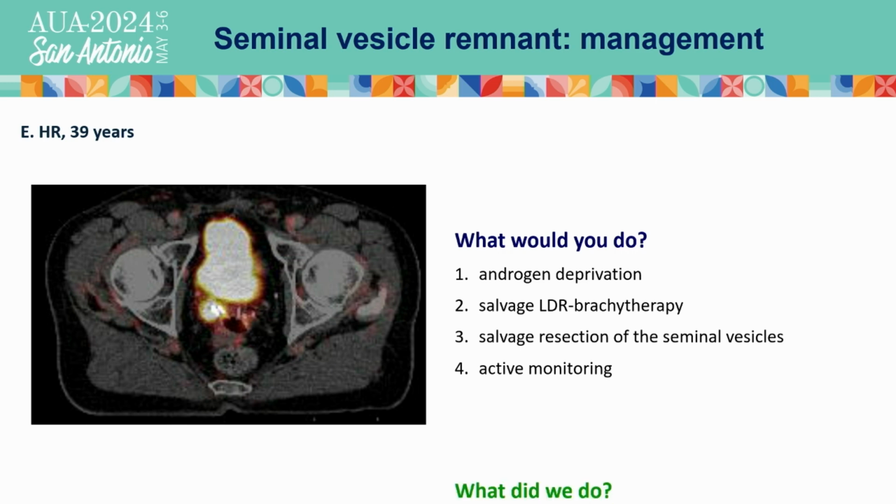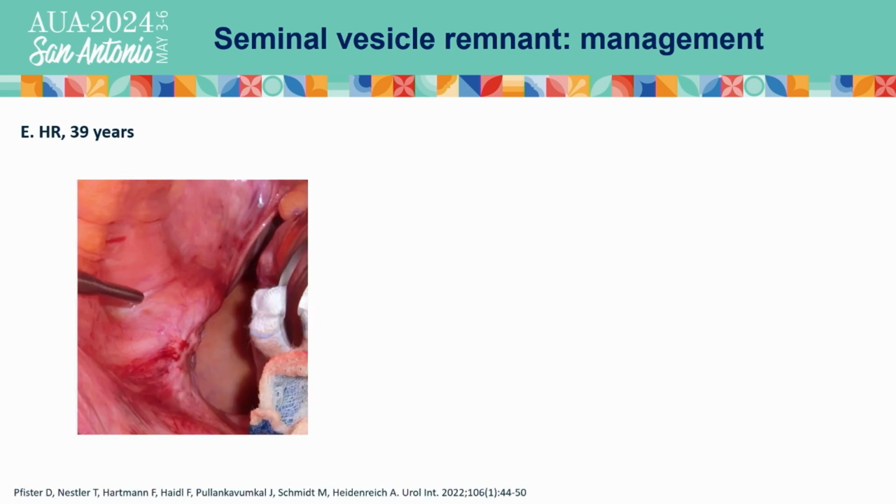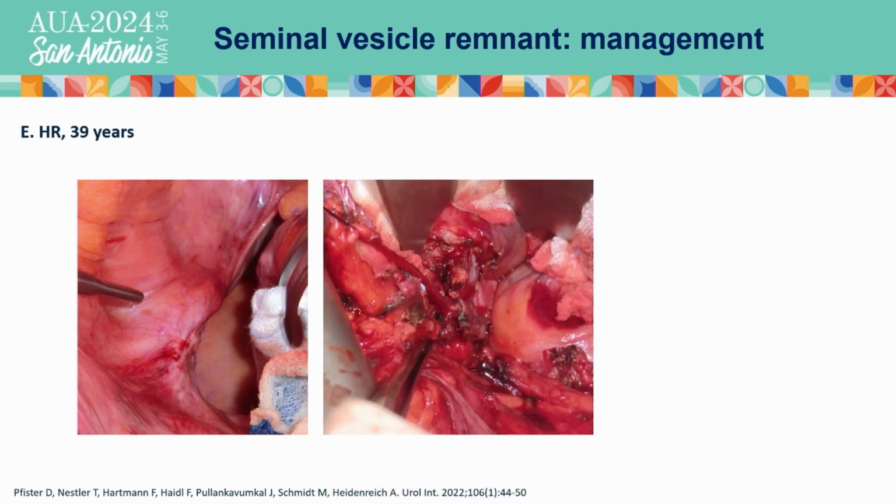Okay. In this situation, we did the salvage resection of the seminal vesicles. When you do it, it's always difficult. We do it with a transperitoneal open approach, and you can see this dense fibrosis in the dorsolateral area of the bladder, so it is very difficult to identify the exact plane between the seminal vesicle, the dorsal wall of the bladder, and the anterior wall of the rectum. So what we usually do is identify the spermatic cord or the vas deferens at first, and then we use the vas deferens as the anatomical landmark to guide us to the seminal vesicle.